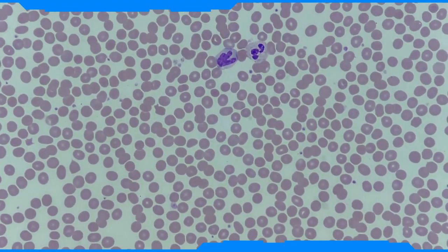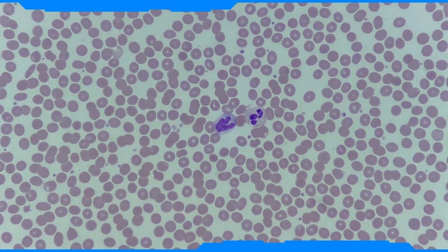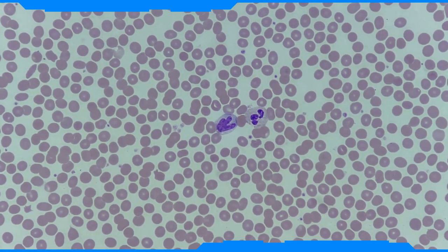The next thing to look at is the staining itself. The red cells should appear a pinkish salmon colour, but depending on the stain used and its pH, the actual colour may either be brighter or duller.